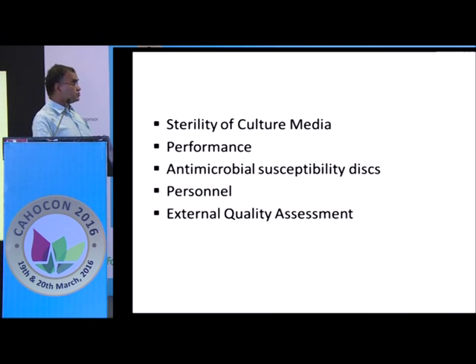So if you want to look at all these things, you need to use appropriate culture media, performance, and then for antibiotic susceptibility. Of course, it is not to underline the fact that the personnel who are performing the test play the key role, and therefore their role cannot be underemphasized, very vital. Then as a part of continual improvement, the lab should participate in an external quality assessment, or EQA. So that, I think, goes without saying if you want to keep the quality of your lab under tight conditions.